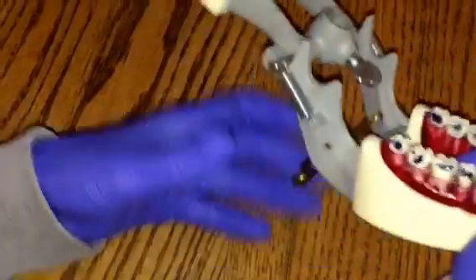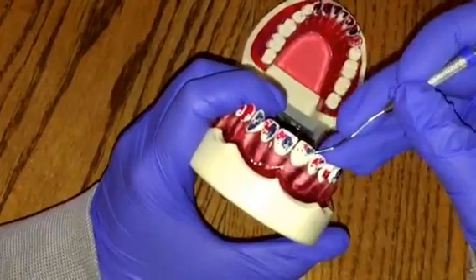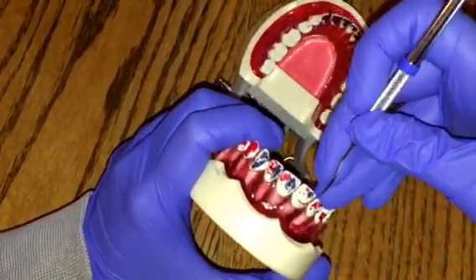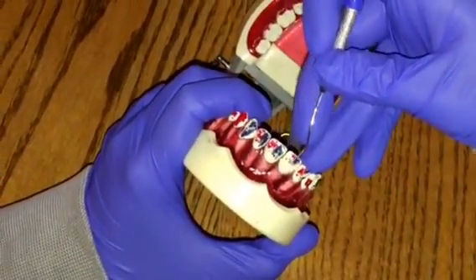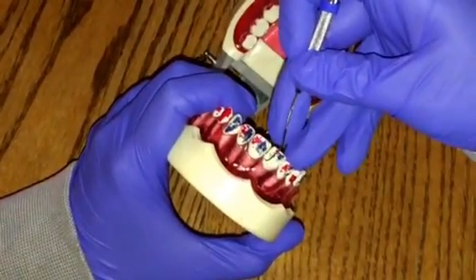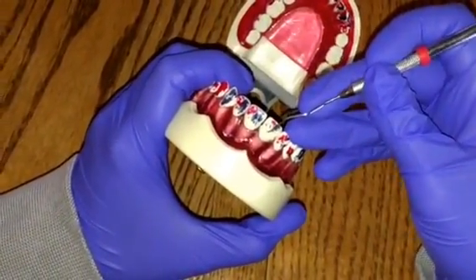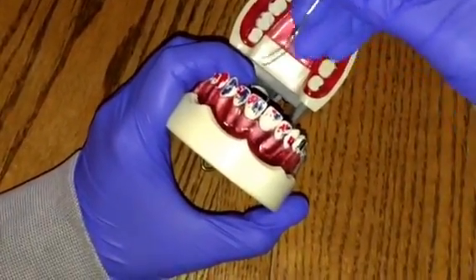Now I'll go on to number 8. So this here is number 8. I'll be doing surfaces away from the facial. So that would be the correct end selection, making that terminal shank again parallel, and the handle is going towards the way that I'll be working. So if I were to use this end, making it parallel, that would be the wrong end selection.